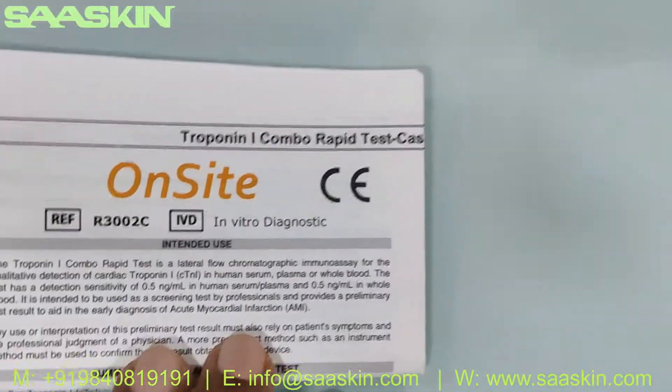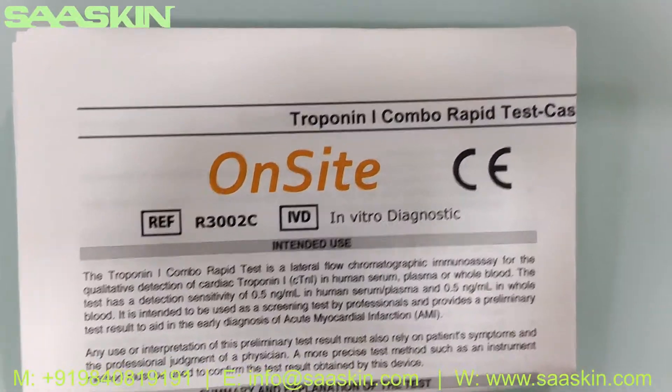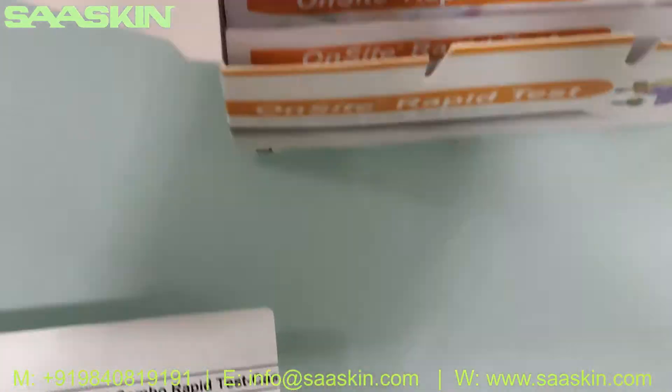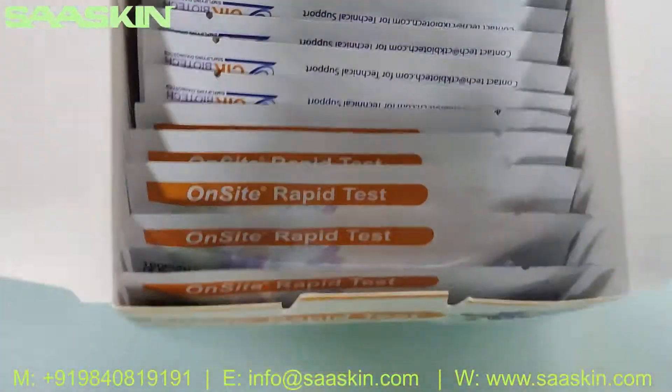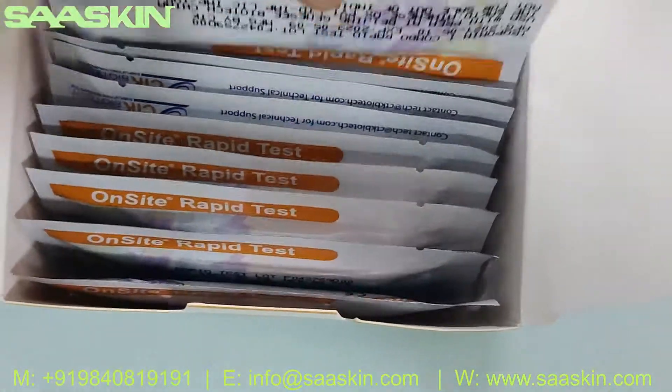Inside the box there is an instruction manual — the IFU brochure. You can see it says OnSite rapid test kit for Troponin I Combo. You can also see the 10 test kits — this is a 10-test kit pack with 10 test cassettes.